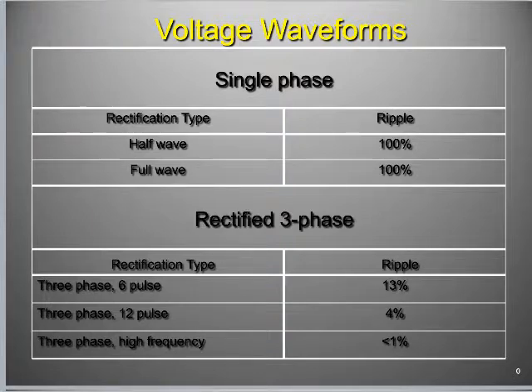On this little illustration, it tells me it's a 60 hertz wave because power waveforms in the United States of America are 60 hertz, right? Versus if you go to plug your hairdryer in Germany, it's a different hertz. So you'll hurt yourself. That means that every second, there's 60 cycles of this waveform. Well, what's a cycle? A cycle is a wave up and a wave down. So there's 60 waves up and 60 wave downs every second at 60 hertz. That's what it tells me down below, and I've underlined it.